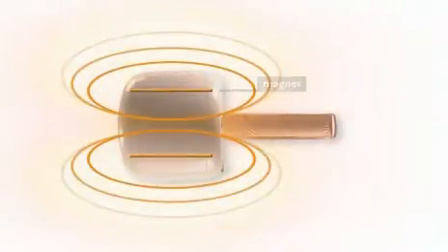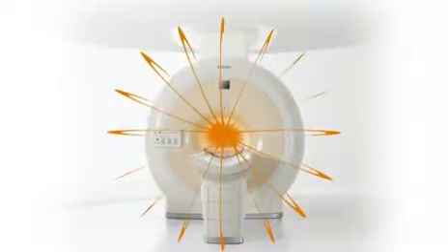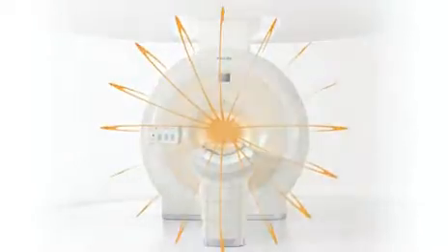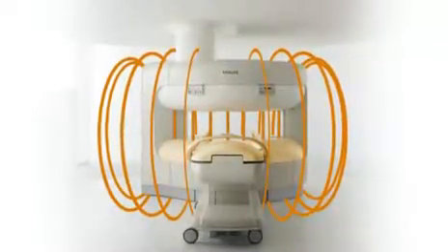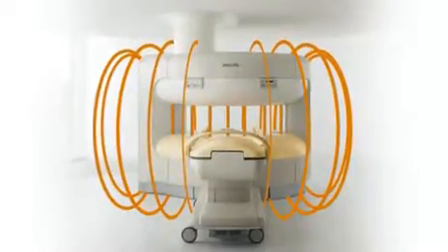All magnets are surrounded by a magnetic field, represented by the magnetic field lines. In a cylindrical system, the field lines are horizontal, but in an open system they are vertical. This means that the magnetic field around the magnet is different, creating different effects within the field.